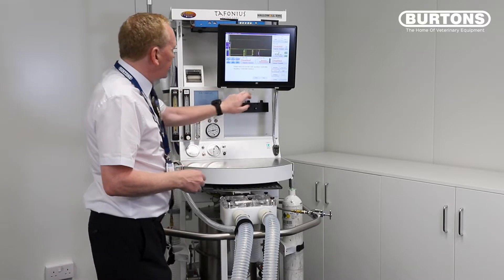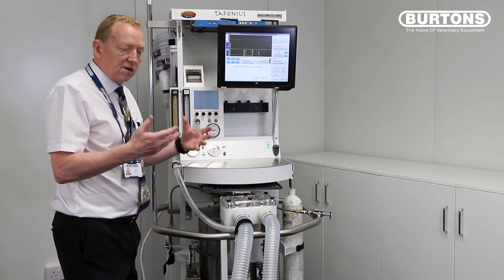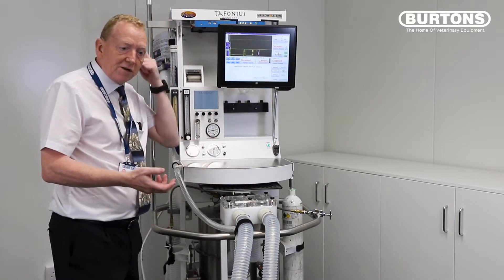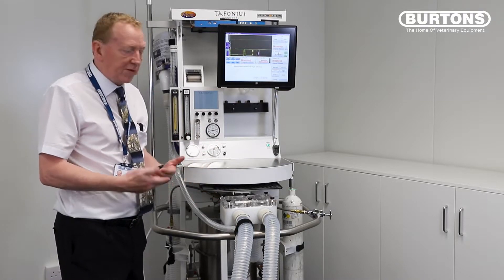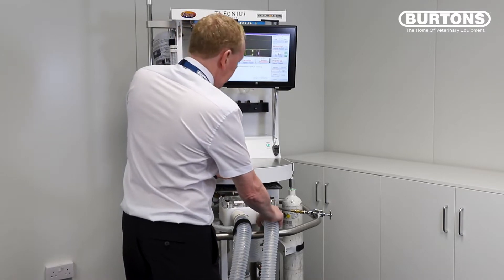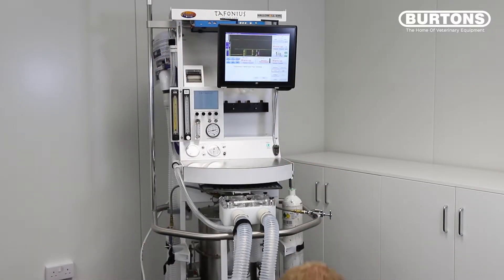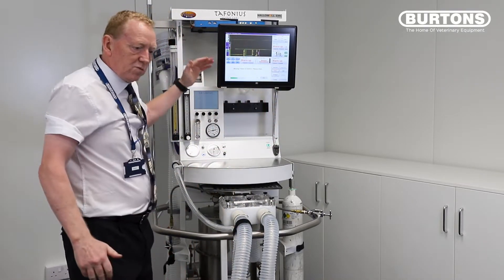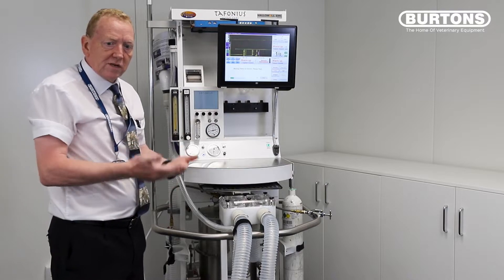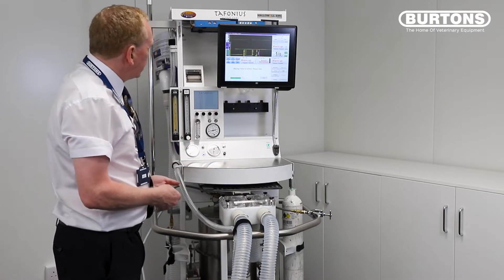Machines come on — we're just going to do the initialization. When the machine starts up we need to zero the piston, much like you zero a set of weighing scales, just so we know the absolute position of the piston before we start. So we need to disconnect the patient — we're going to take the stopper from the end of the tube and then press the piston to initialize. The piston will go down to the bottom, do the zero procedure, and then we'll be ready to do our leak test.